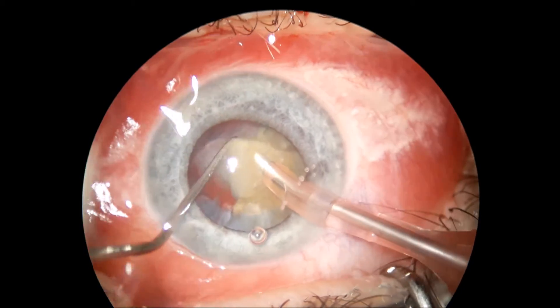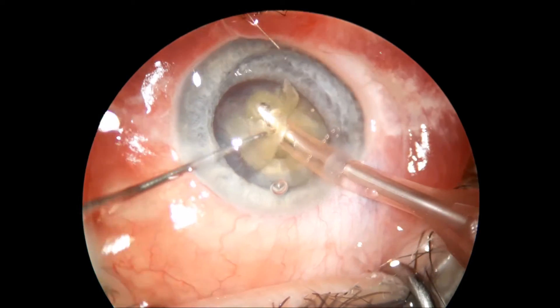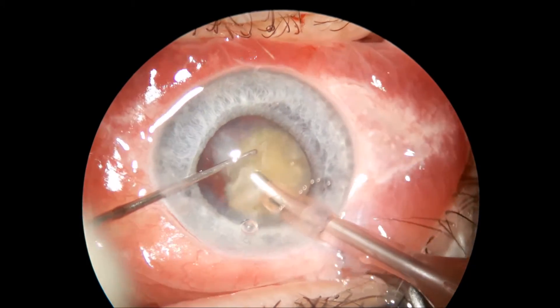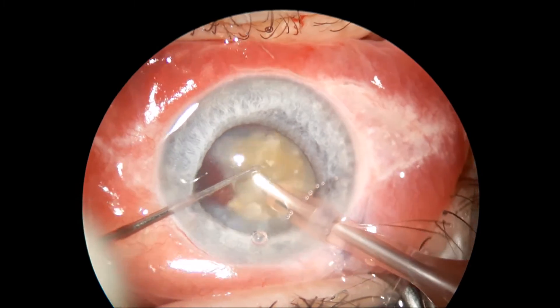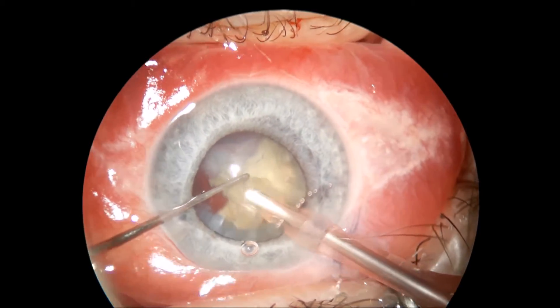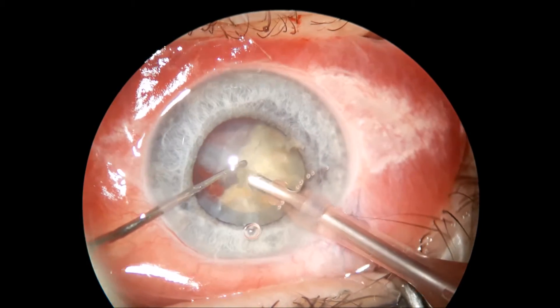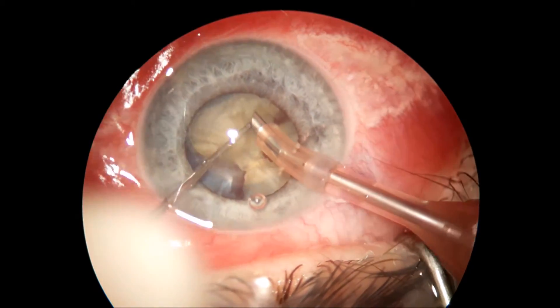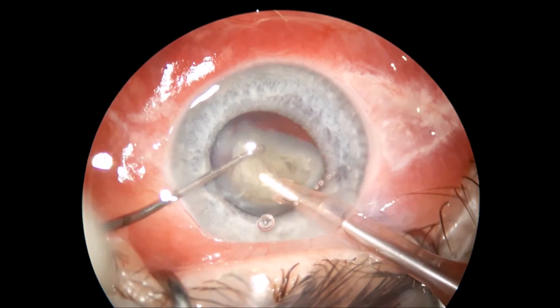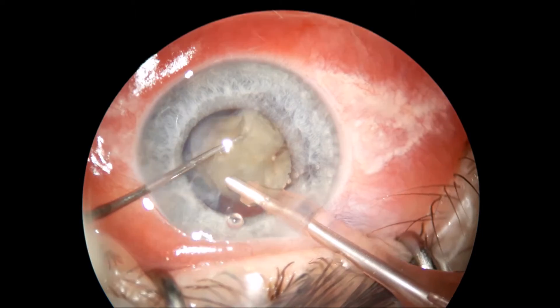You have to be very careful with the foot pedal in this case, otherwise a rent in the posterior capsule is very easy to get with the phaco tip facing down.